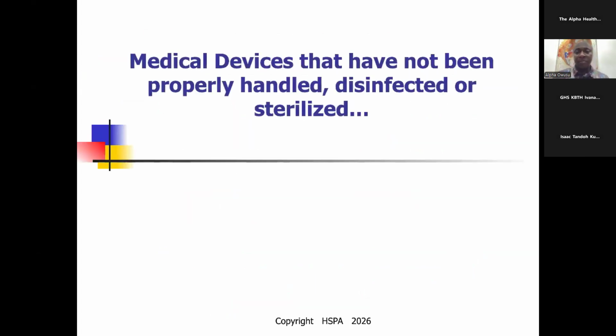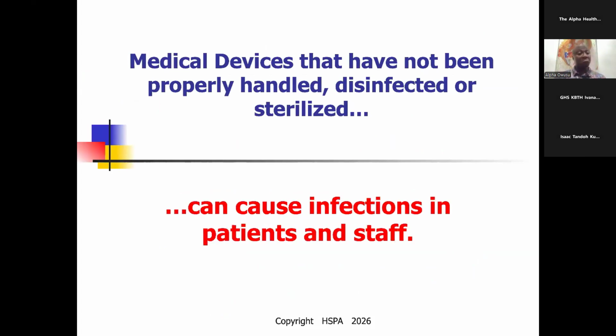Again, medical devices that have not been properly handled, disinfected, or sterilized, right? They cause infection. They can cause serious infection and to our staff, right? Our staff come from home, they wear their shirts, their mufti, their street clothes, right? They go home, they sit in the trotros, the taxis, the Ubers, and then they go to the sterile processing area. They handle this instrument.